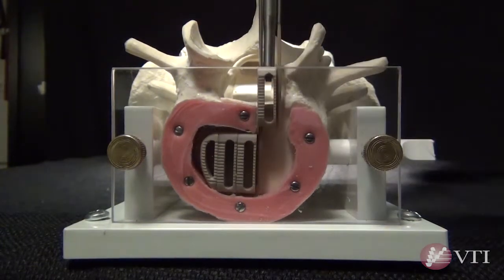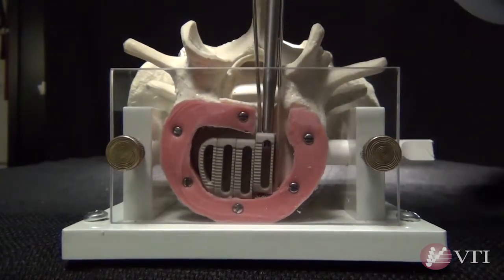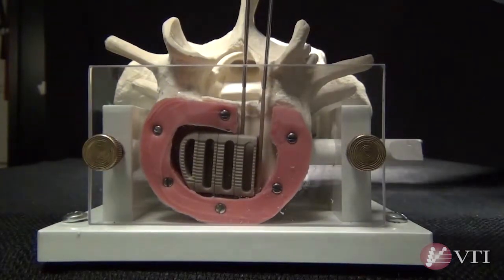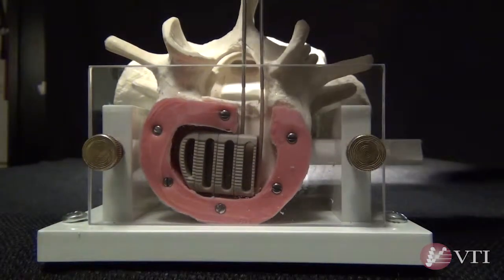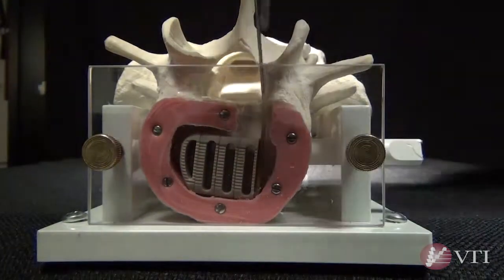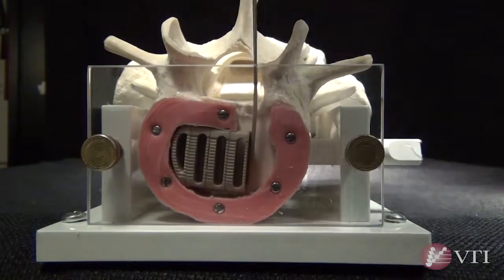Most patients are expected to require five segments utilizing two additional B segments and the final C segment. Special attention should be focused on ensuring that the C segment is properly aligned with the insertion tool when threading it into the segment to avoid cross threading.